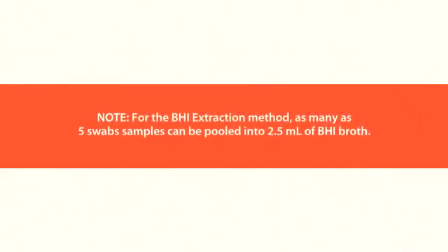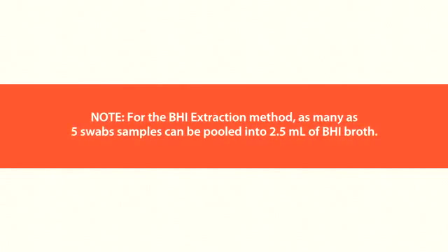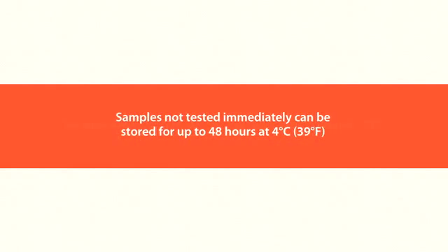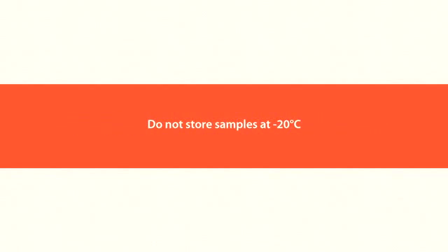Note, for the BHI extraction method, as many as 5 swab samples can be pooled into 2.5 milliliters of BHI broth. If samples are not to be tested immediately, they should be stored in the appropriate manner. Samples can be stored for up to 48 hours at 4 degrees Celsius or 39 degrees Fahrenheit. For more prolonged storage, samples should be kept frozen at -70 degrees Celsius. Do not store samples at -20 degrees Celsius. Do not store samples in a self-defrosting freezer and avoid multiple freeze-thaw cycles.